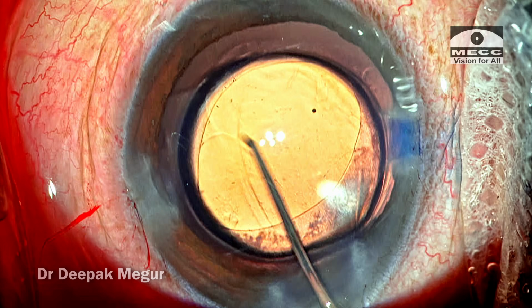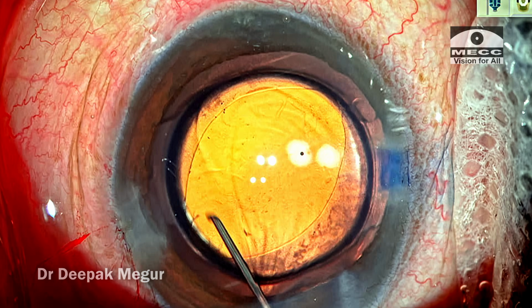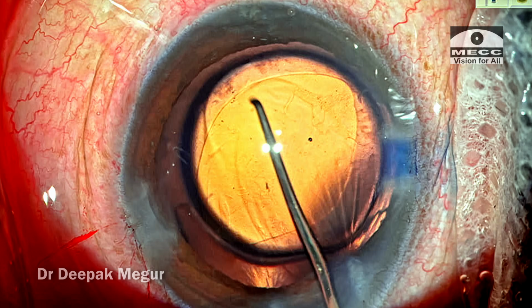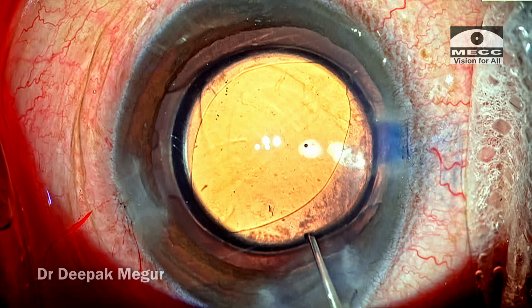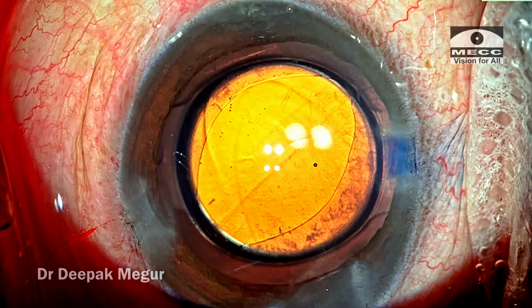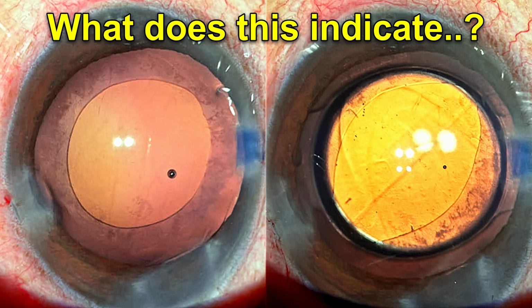Well, this is unusual, so I just go in, tap the lens to ensure that the haptics are all free and unrolled and they're in the place. And everything looks fine. Even after nudging the lens around, the shape of the rhexis does not come back to its original circular one. So what does this indicate?